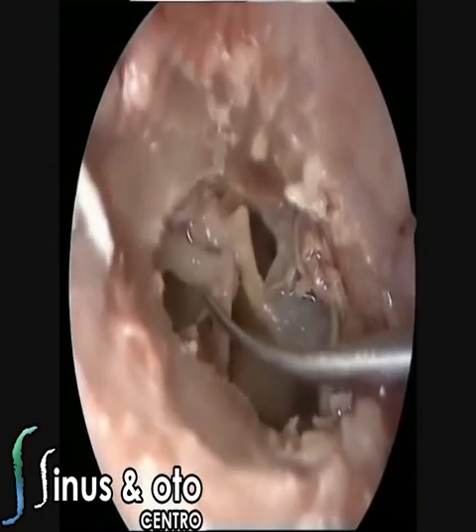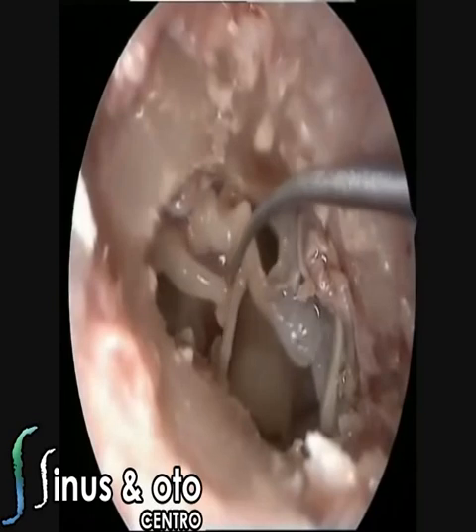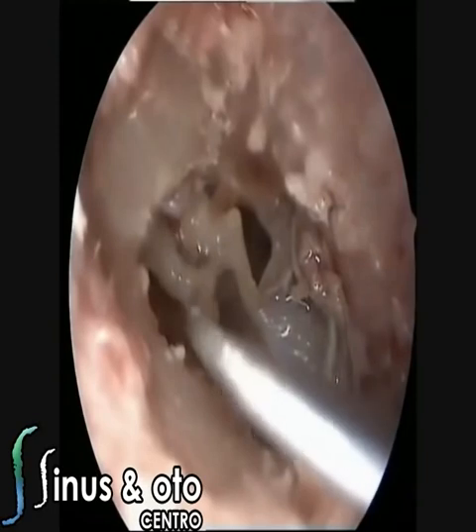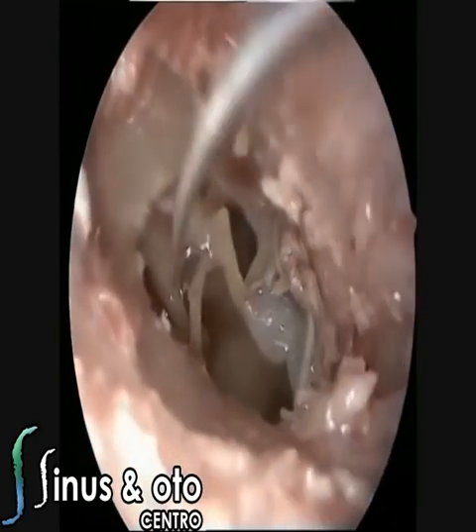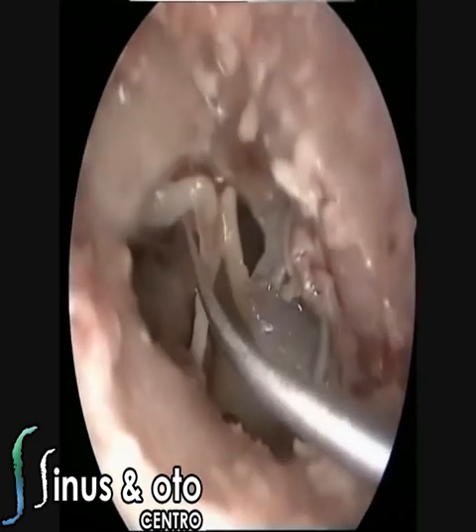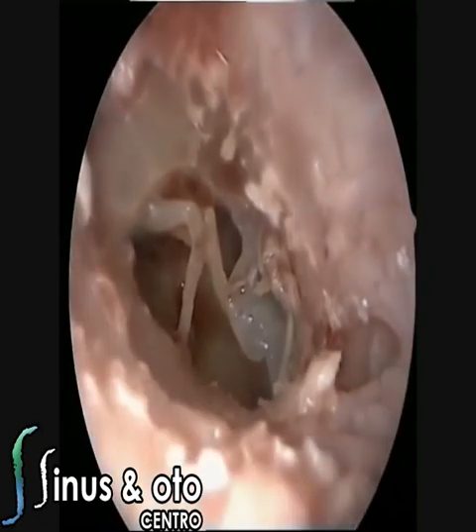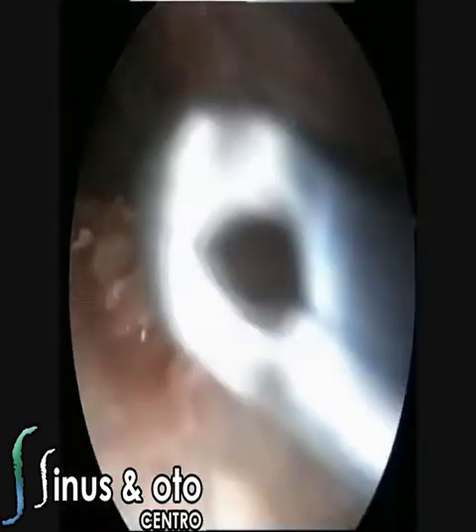Of course, when you remove the incus, you open a lot the ventilation pathways, the ventilation routes, especially the main ventilation pathway, which is from the eustachian tube, passing through the tympanic isthmus and going through the mastoid antrum and the mastoid cells. Of course, when you do this, you can have an auditory problem because the ossicles together are responsible for transmitting the sound that is captured by the tympanic membrane, amplifying the sound and taking it all the way to the cochlea.